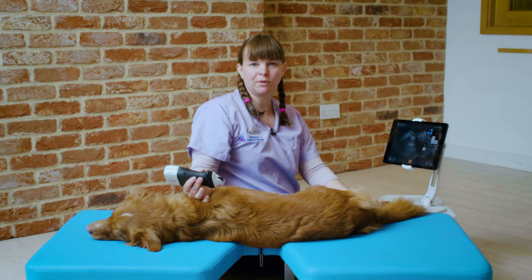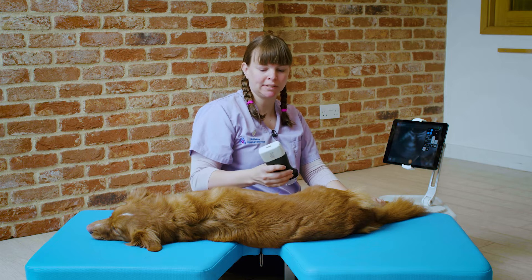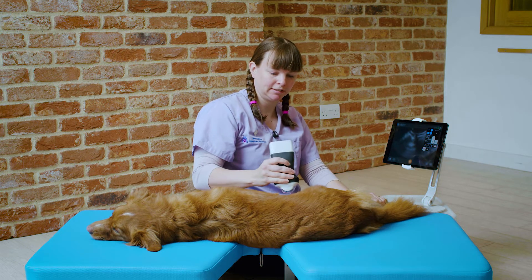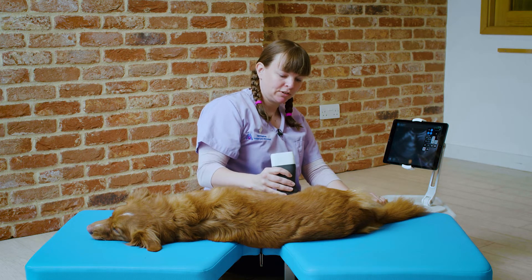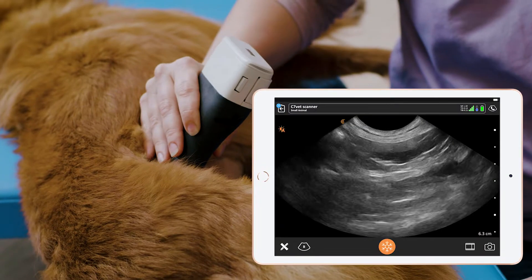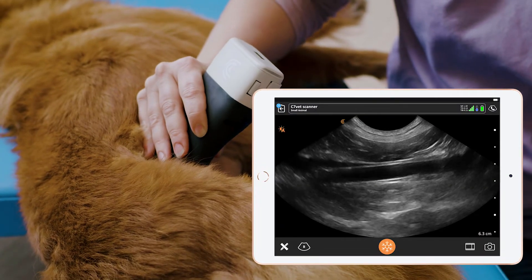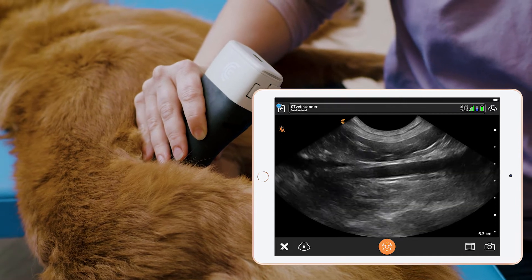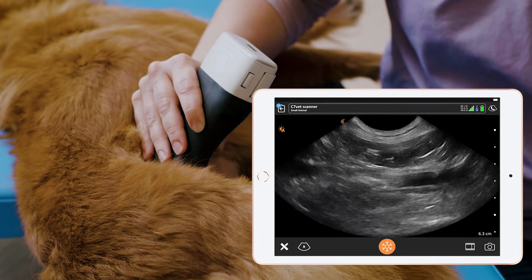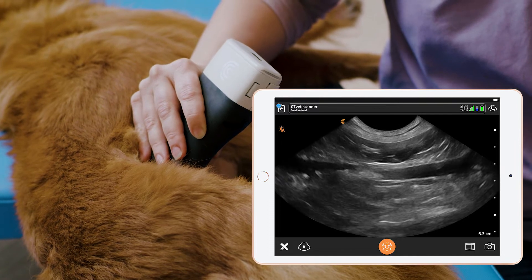So now we've turned Pippi over into left lateral recumbency and we're going to look for the right adrenal gland. Again, we want to look for the dorsal blood vessels. From this side, the nearest vessel we'll find is the caudal vena cava, which we can see here right next to the aorta.